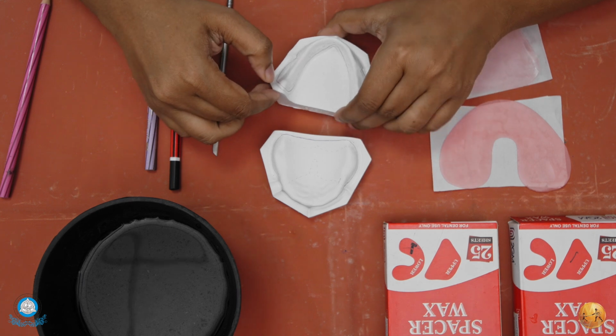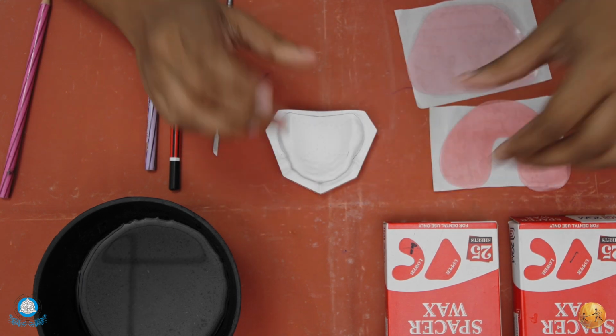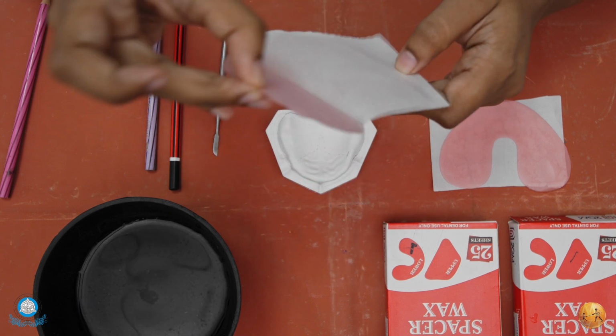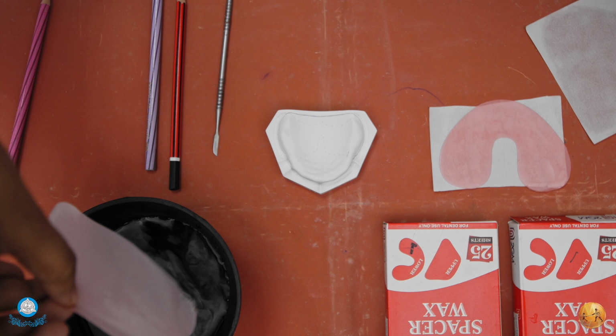First we'll start with the adaptation of the maxillary spacer. To adapt the maxillary spacer, we are going to take a maxillary spacer and keep it in the hot water till it softens.